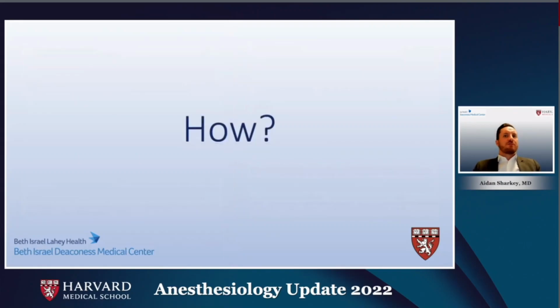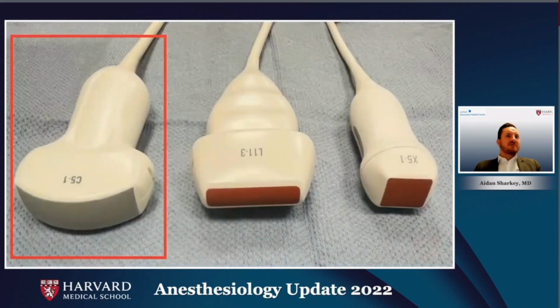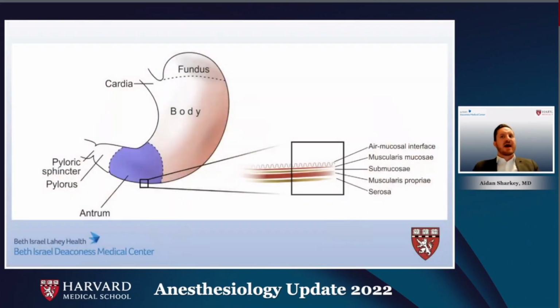So how do we go about performing gastric ultrasound on our patients? When examining adults, a curved array, low frequency transducer is used with standard abdominal settings selected. Using this transducer allows sufficient penetration of the abdominal compartment so as to produce sonographic images of the key landmarks required. When examining the stomach, it is the antrum we typically examine, as the fundus is often difficult to visualize on ultrasound, and the body of the stomach often contains air and so is not very amenable to ultrasound.